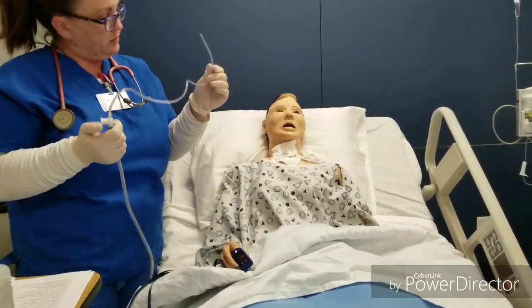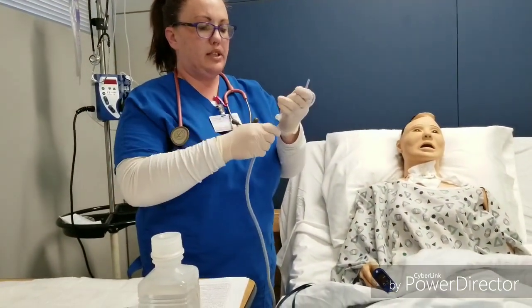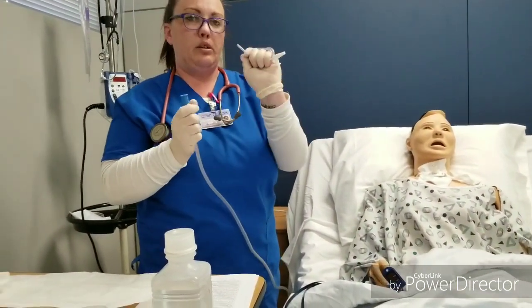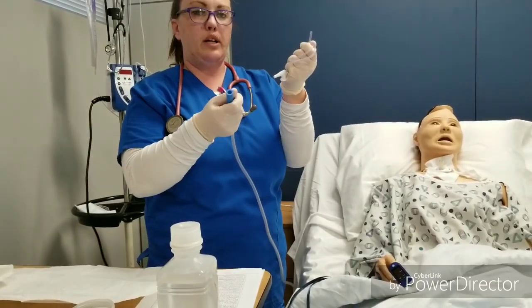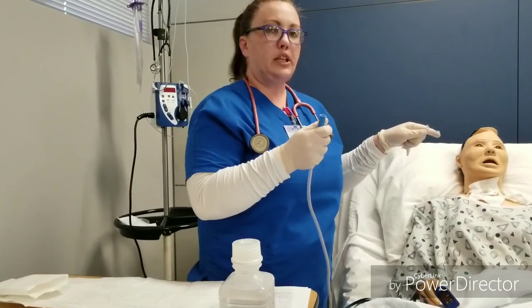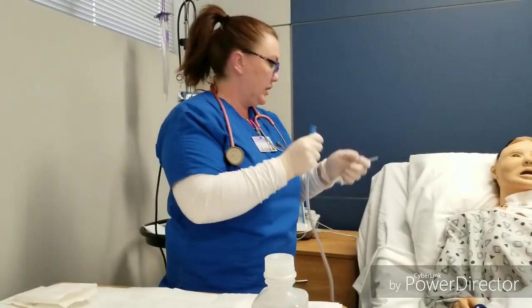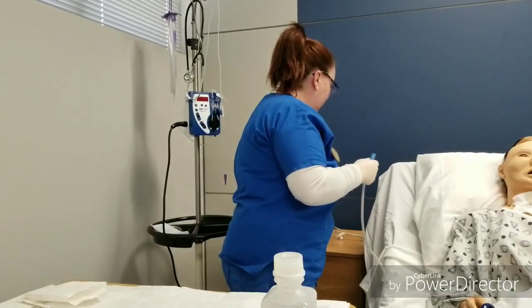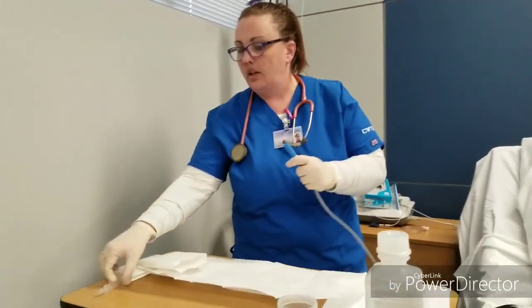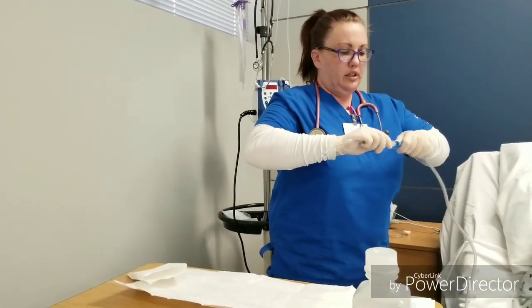Roll. There you go. And to remove this, you would wrap it like this, and then you would wrap your glove around it, but I'm going to do the oral suctioning now, and I'm not going to change my gloves. So we're going to pretend like I took this off, threw it in the trash, and we're going to grab the Yankauer, and this one is not a sterile procedure.